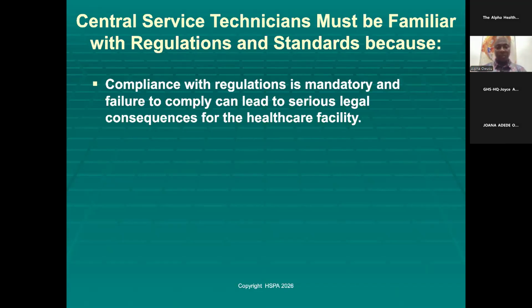When I went to the facilities, you see that there are no compliant measures. Instruments are left in the solution. You see bioburden glaring, right, with your naked eyes. Nobody is checking it, nobody's documenting. Infection prevention is not following up. Quality is not following up. So we don't have enacted regulations to force them, and the instruments are used on patients.